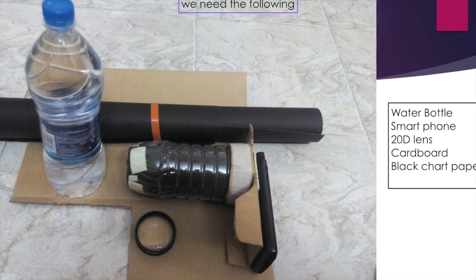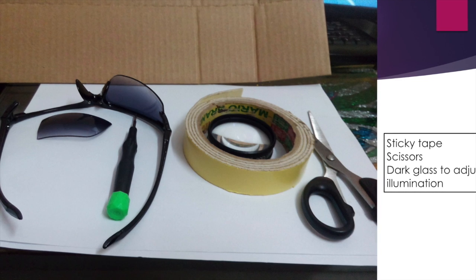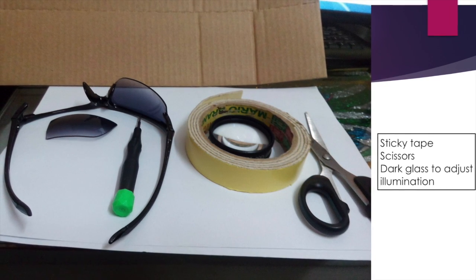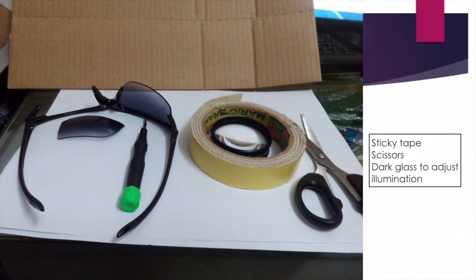You also need to have some sticky tape, a plus 20D lens, a pair of scissors. Some of us will have a phone where the video light cannot be controlled.